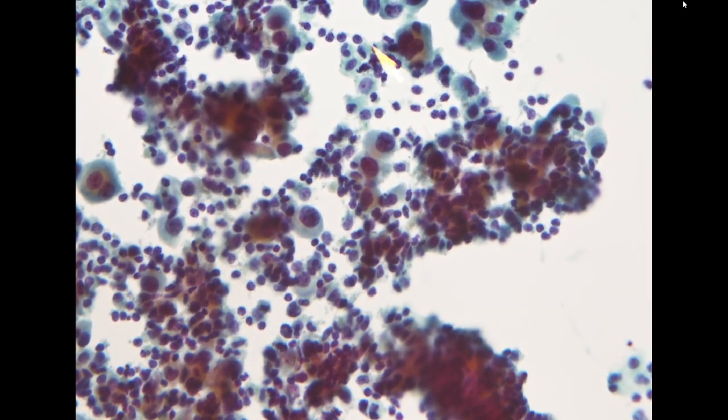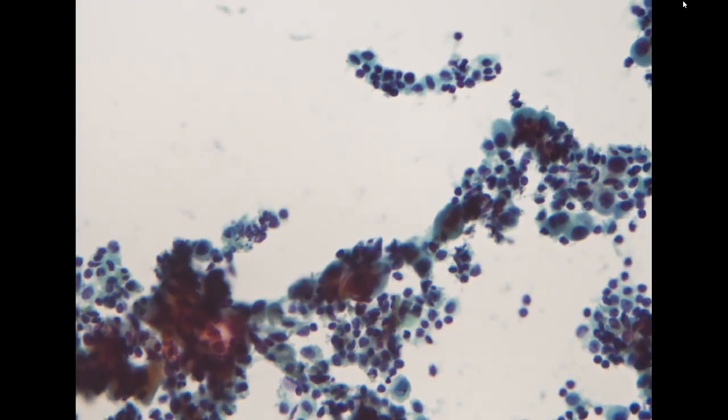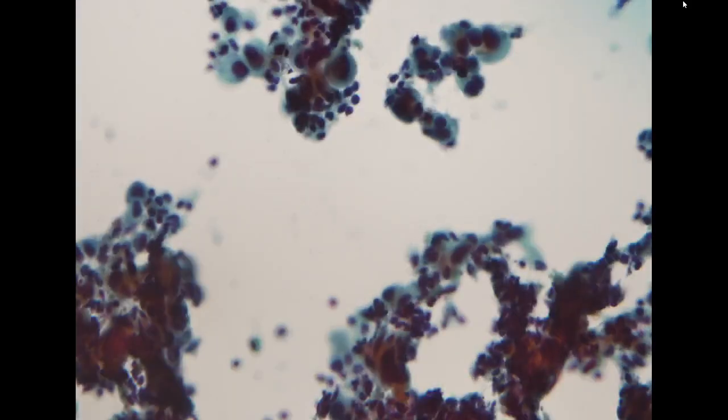So we know that in the background it's a heavy inflammation, so it might cause some reactive changes of mesothelial cells. However, the cells are quite atypical, and some are actually in clusters, which is not common for reactive mesothelial cells.